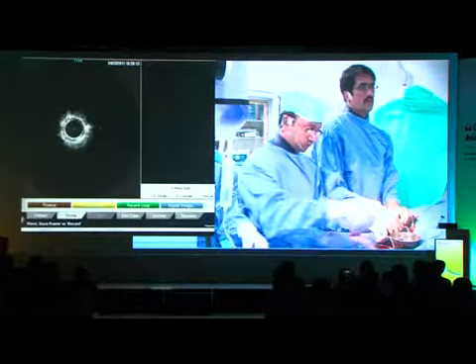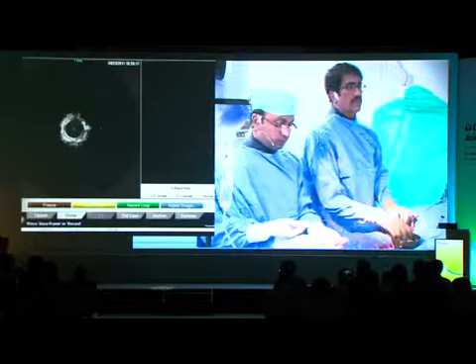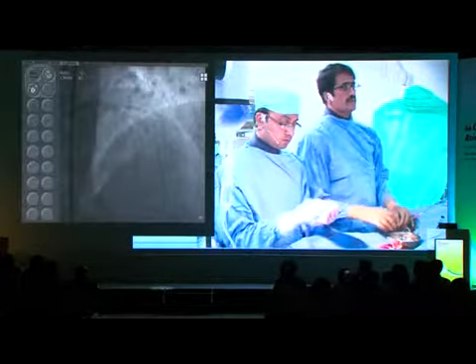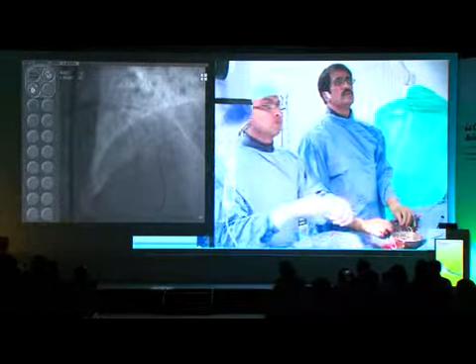Is this the diagonal? Are you sure? Yeah, this is the diagonal. Okay. Sirish, the LAD proximal to the diagonal doesn't seem to be fully expanded. I think there's definitely some undersizing, so we need to dilate again. Let me show you the stent boost.